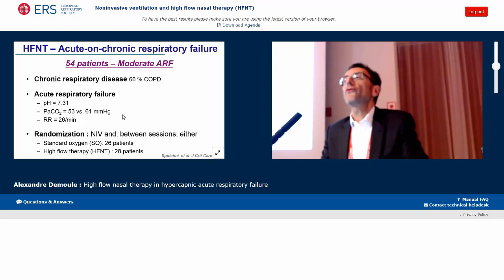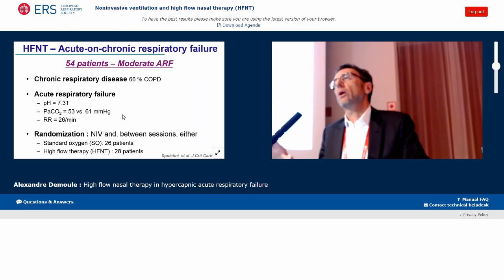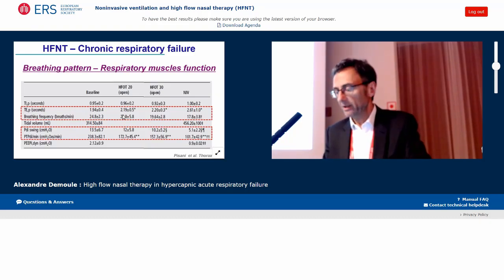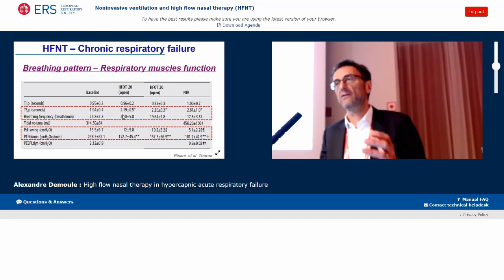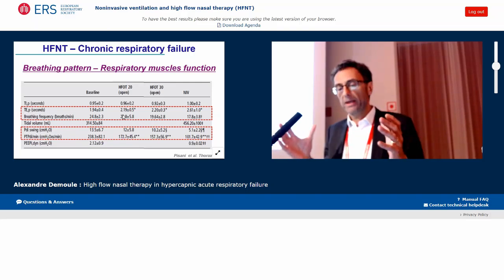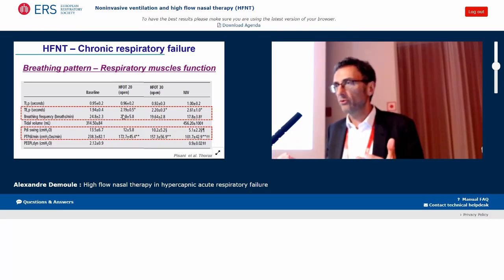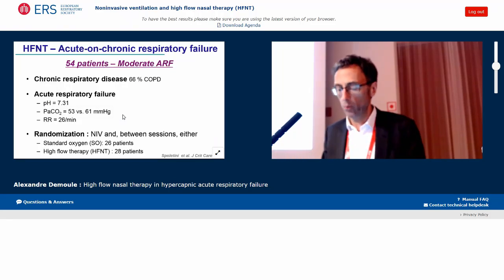So this was, I would say, the first physiological study demonstrating the hypothesis that we decrease the respiratory rate and the drive, and high flow therapy unloads respiratory muscles, a little less than non-invasive ventilation, but it works.